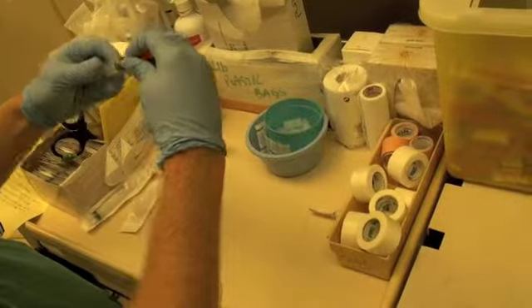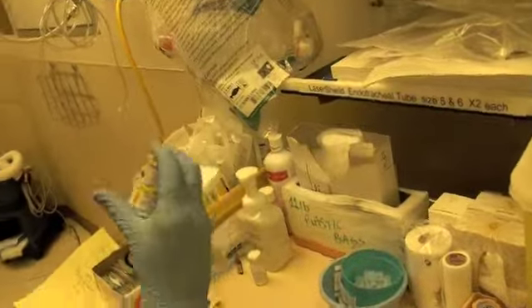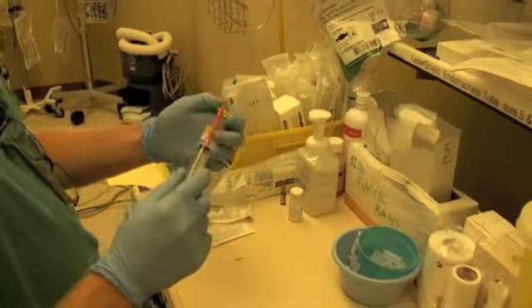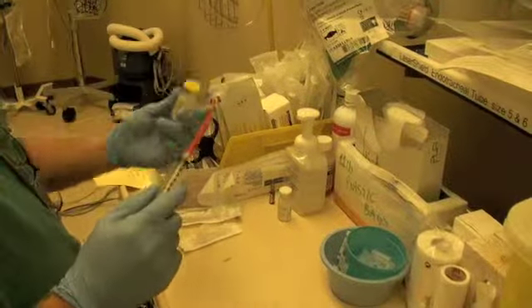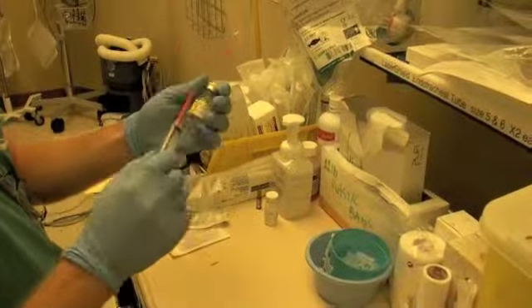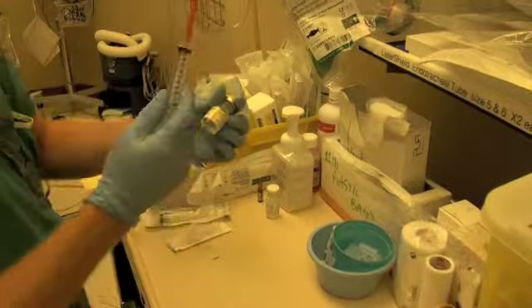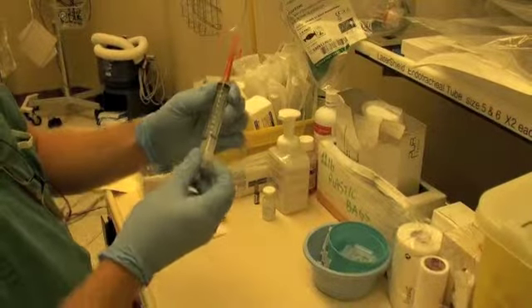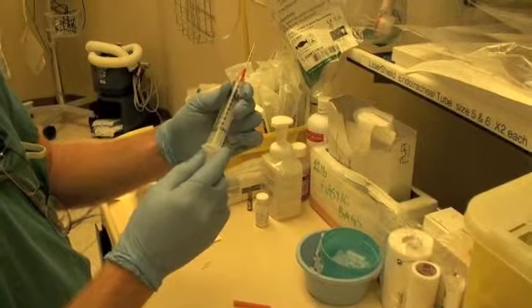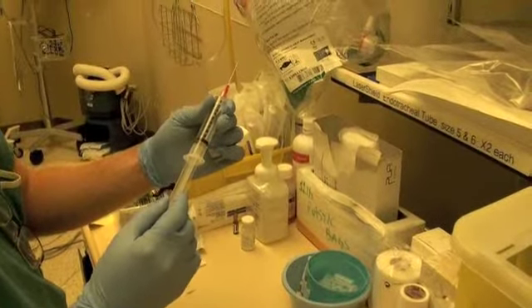Attach the needle to the syringe, and in this case these are single-use vials, which almost everything is, and so in order to easily get this 10 milliliters out of this vial into the syringe, we're going to inject 10 milliliters of air to replace the 10 milliliters of fluid that we're going to be drawing out. So take the cap off, we'll draw back 10 milliliters of air into our syringe.